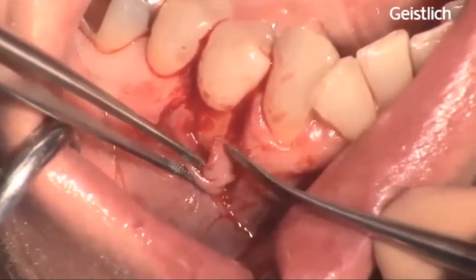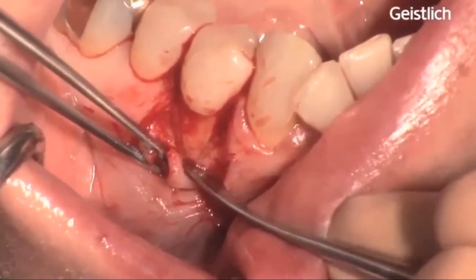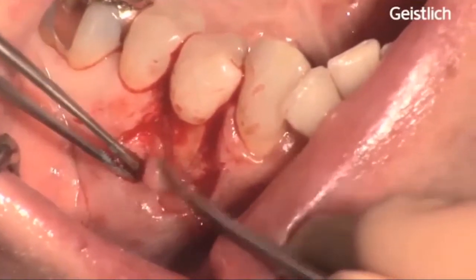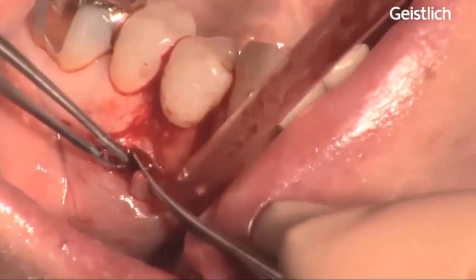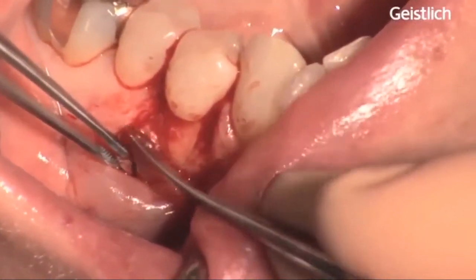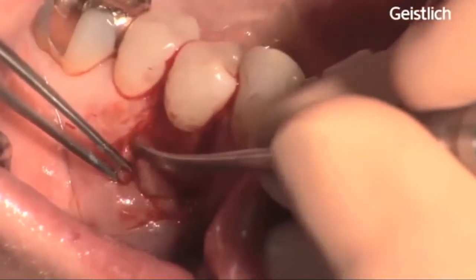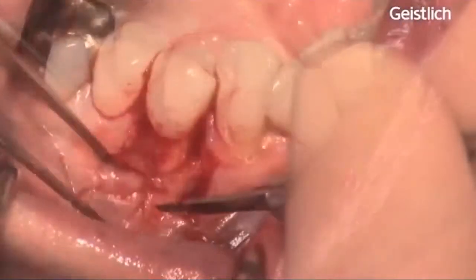The soft tissue apical to the root exposure is elevated as a full thickness flap by using a small periosteal elevator to expose 5 mm of the bone apical to the recession defect. This is done to include the periosteum and the maximum soft tissue thickness in the central portion of the flap.